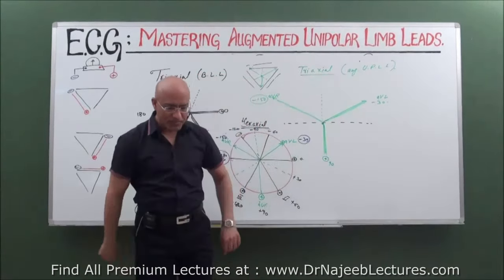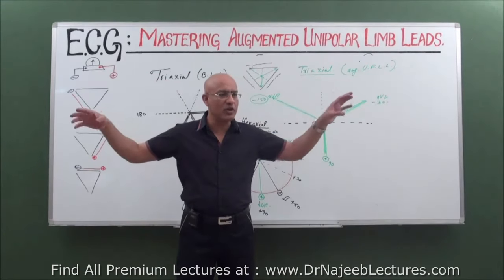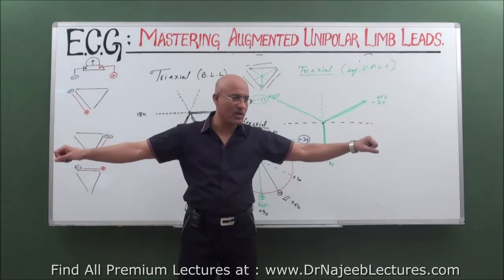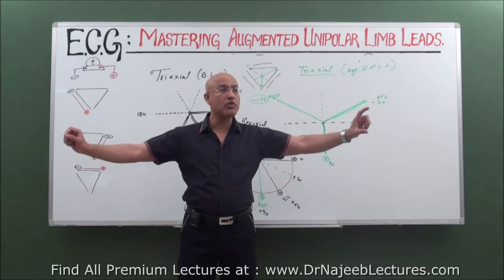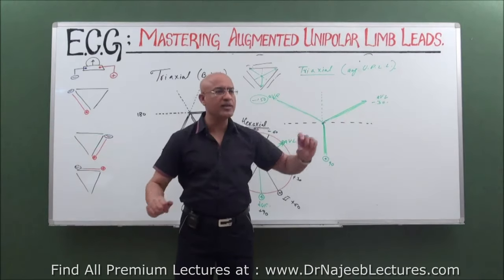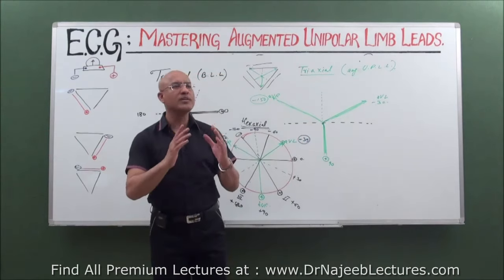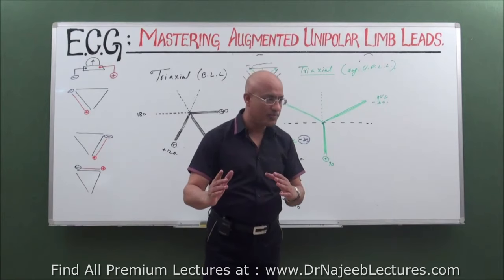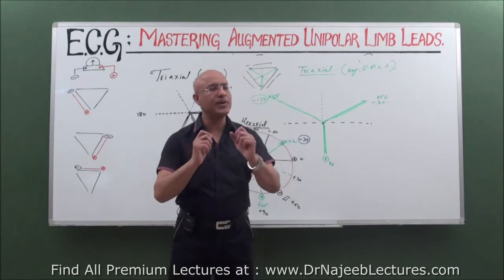You will tell me: first of all, the difference between bipolar and unipolar. If I am the electrode machine, this is the negative electrode and this is the positive electrode. In bipolar leads, the positive electrode is referenced against the negative electrode. In unipolar lead, the positive electrode is referenced against the indifferent electrode. What is an indifferent electrode? An indifferent electrode has a potential near zero. How is the indifferent electrode made?